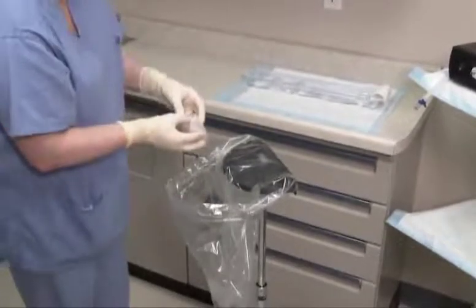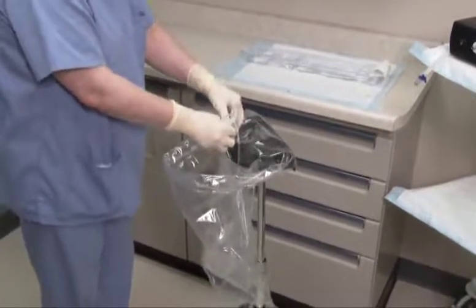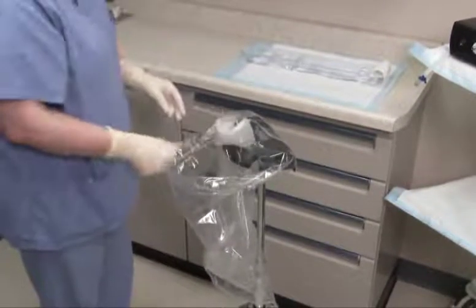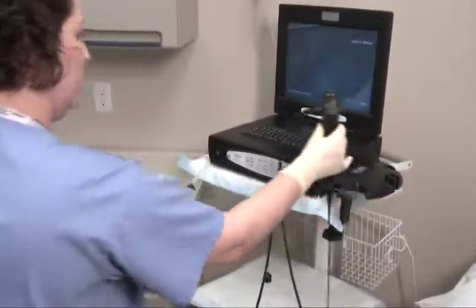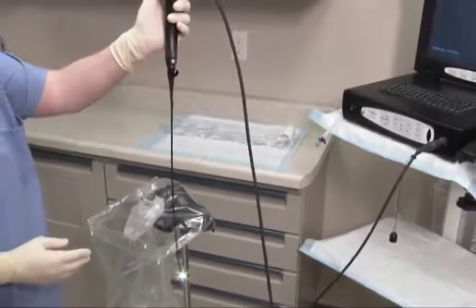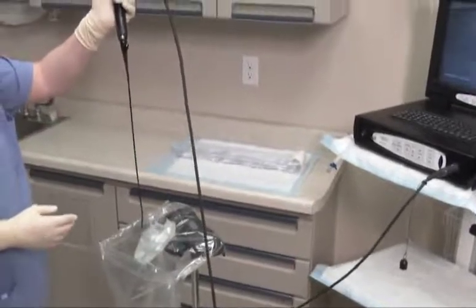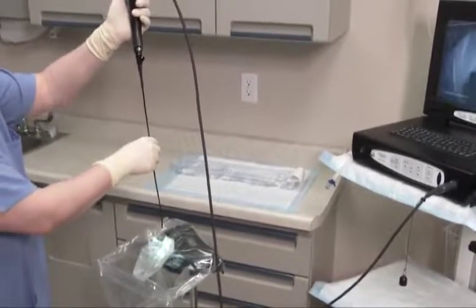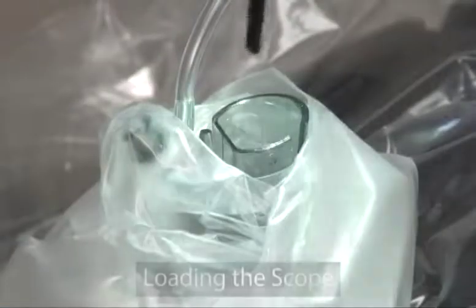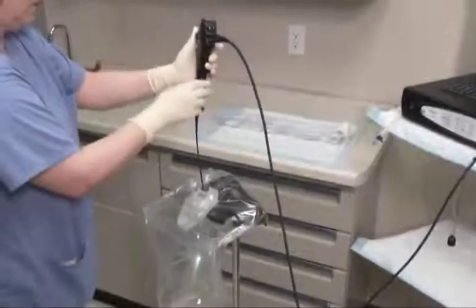The sheath must be placed into the stand with the accessory port facing toward you. Note that the sheath fits into the stand in only one direction. Fold back the control body cover to expose the top opening of the Endosheath connector. Before inserting the cystoscope into the sheath, it is important that the articulating distal end of the scope is straight or in the neutral position. While standing directly in front of the installation stand, hold the cystoscope vertically over the sheath connector and align the scope's D-shaped insertion tube with the D-shaped opening of the sheath connector. The flat side of the scope must be matched up with the accessory port and tubing.